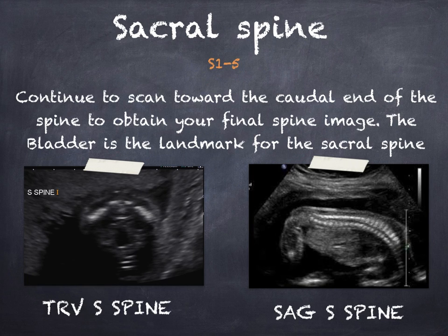The spine concludes with the sacral region, and the bladder is your landmark for the sacral spine. Be sure to image the spine coming to a smooth tapered end in the sagittal view.